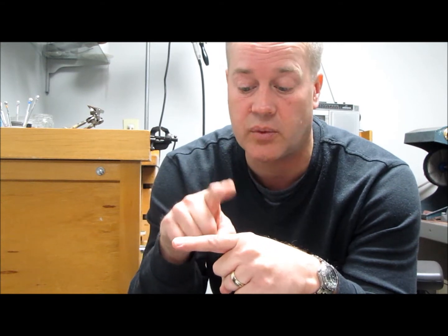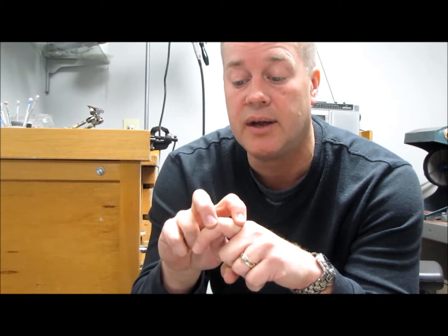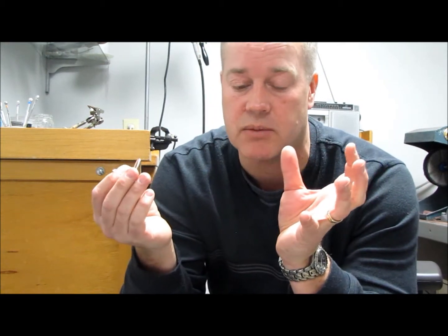So for hypermobility, if we can apply 3 basic pressure points, again, to stop the hypermobility, between the MCP joint and the PIP joint, right in the middle there, and again between the PIP and the DIP joint, as well as right under the joint, we can still allow your finger to fully flex, but as you extend, we can stop the hyperextension. By doing that, I use what we call an anti-swan neck splint, or a swan neck splint, or hypermobility splint. There's many different names for it.